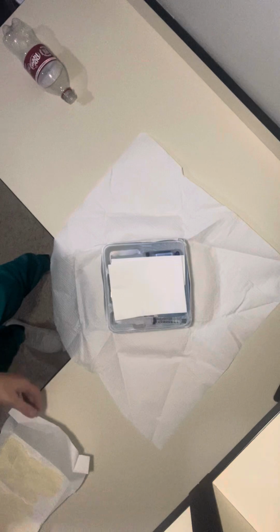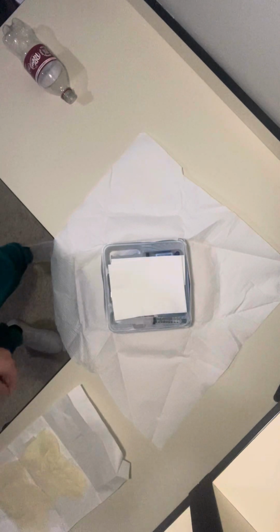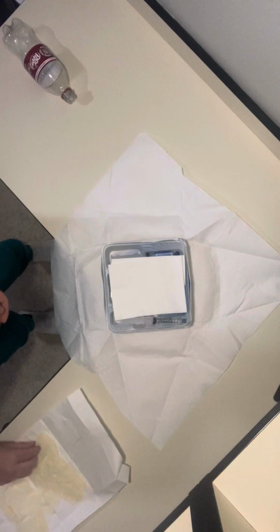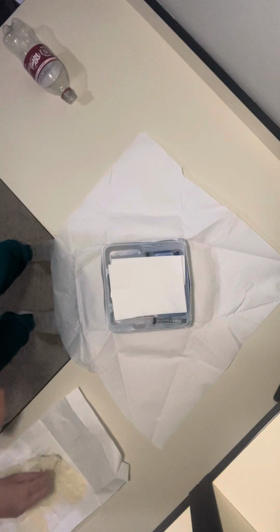And if I touched my sterile field, which I would do it away, but I'm trying to stay in the camera, obviously I would get rid of my contaminated kit and obtain a new kit. And I would only touch the outer edge of the border. Okay, so I would grab the glove by the cuff.